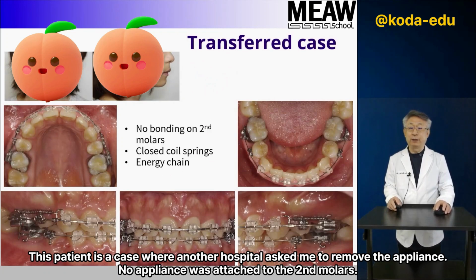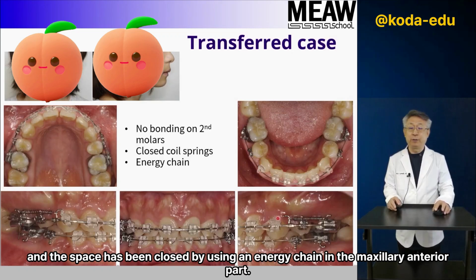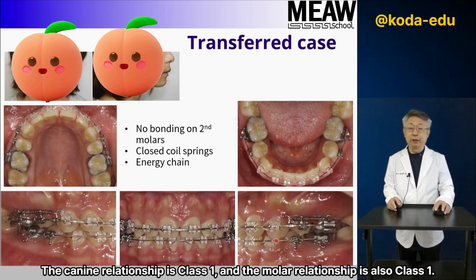No appliance was attached to the second molars. The extraction space has been closed by using a closed coil spring from the maxillary hook to tooth 6. And the space has been closed by using an energy chain in the maxillary anterior part. Should we remove the appliance or not? We need deep consideration. The canine relationship is Class 1, and the molar relationship is also Class 1.